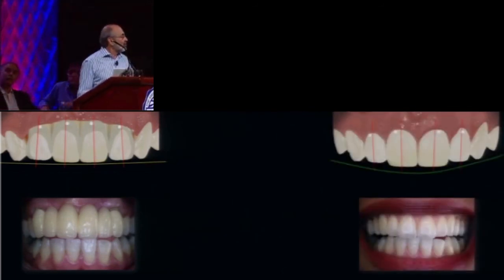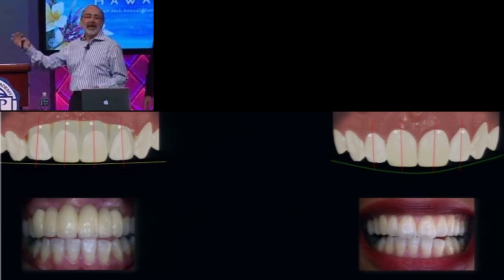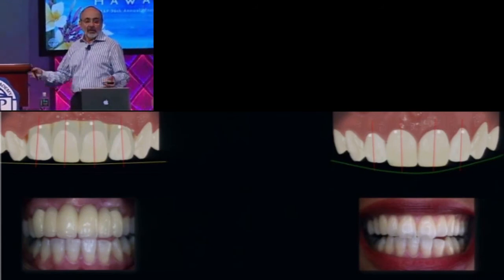Because if we don't, the restorative dentist that you're working with ends up trying to make these teeth fit into the tissue and then integrate it back into the face. You can kind of see the things that I, as a restorative dentist, send an impression back to the laboratory, and I say, make me some teeth. And then, you know, teeth are not all created equally. Look at the difference in form on the same case, actually, between these teeth and these teeth. And how do we facilitate this?